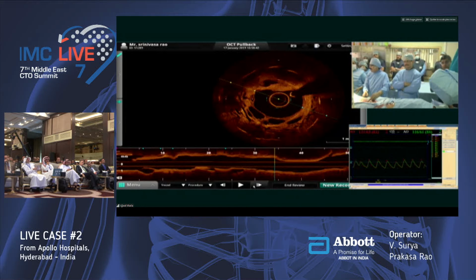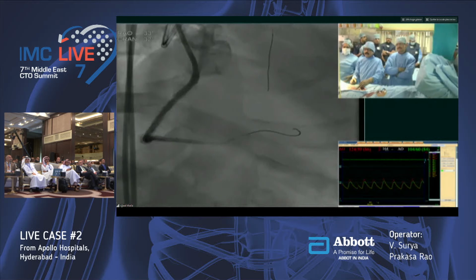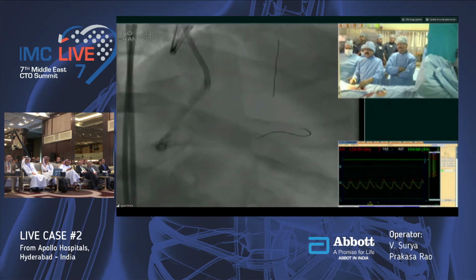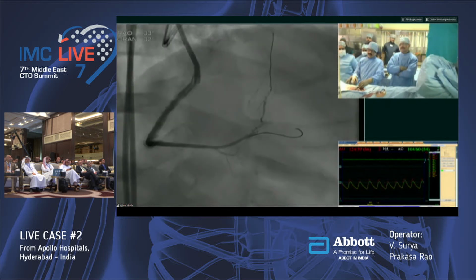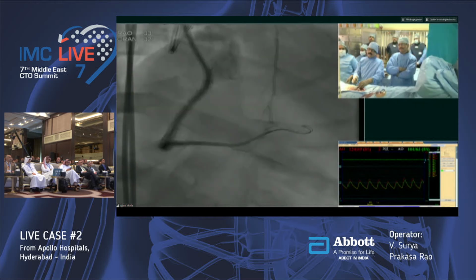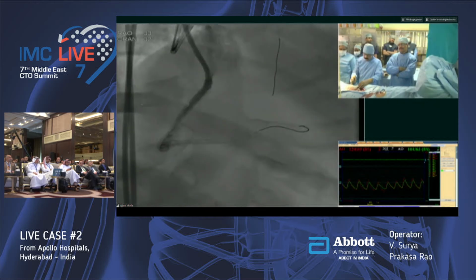We got here a Magic Touch sirolimus balloon, which we quite often use here. There are 3 stents here. The distal one is 3 into 37, put a long time, 3 years back. So we are doing a DEB with a 3 into 40 balloon for the distal segment.